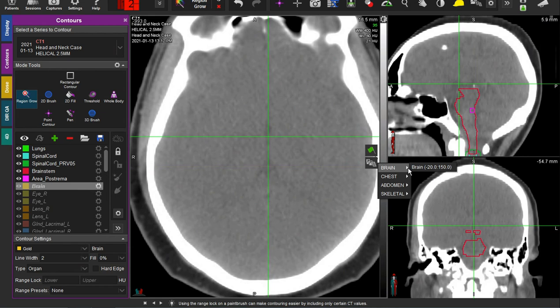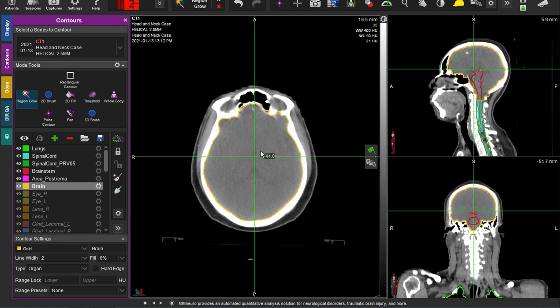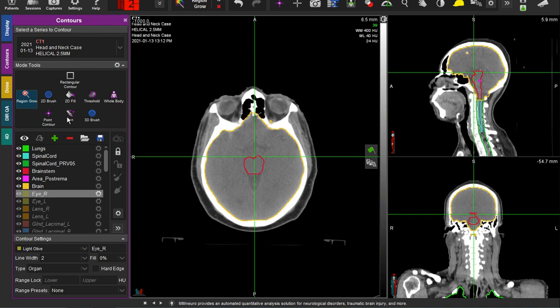Now we are in the brain — we're going to do a region grow. This is MIM software, and I look at the bottom and like to bring the bottom down to the bottom of my brainstem just to be consistent. There's the brain, and now since we're up here, we will work our way down, starting with the eyes.